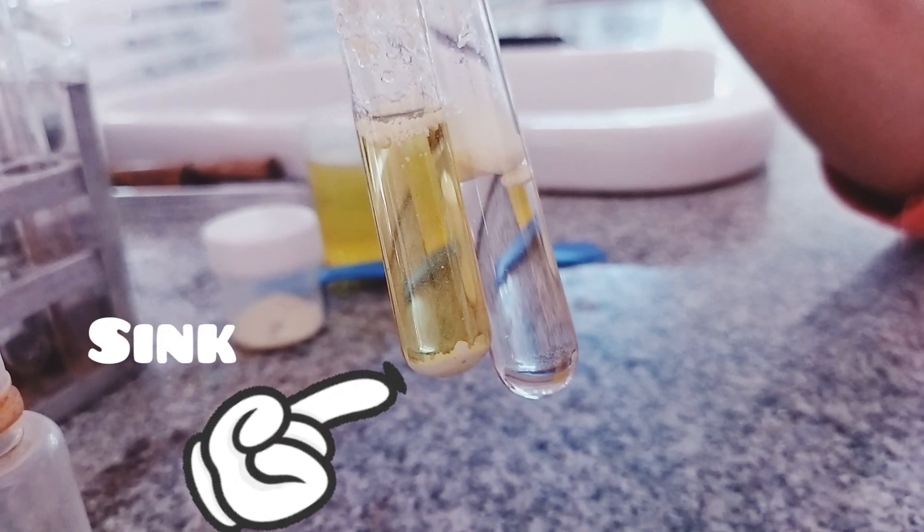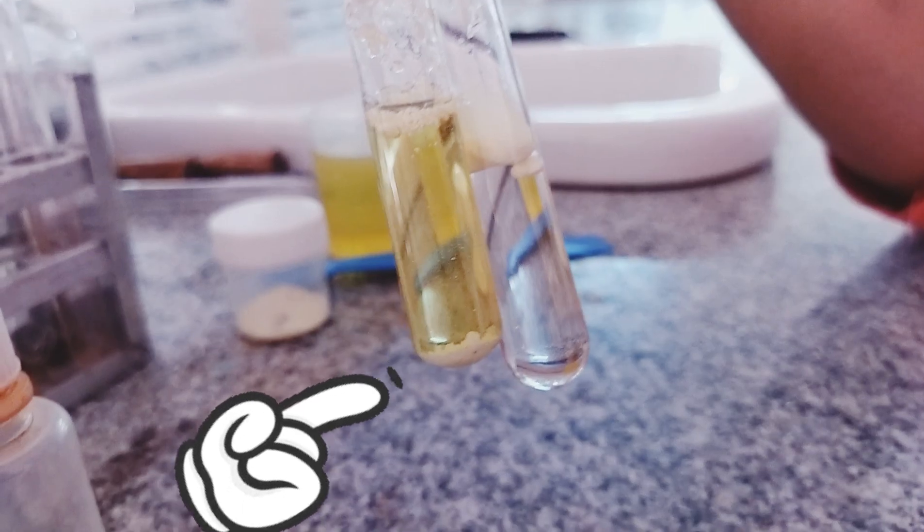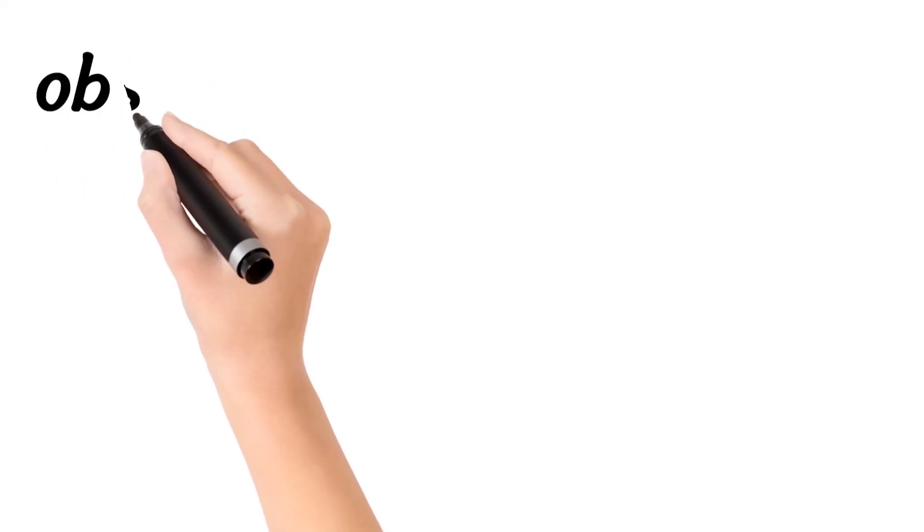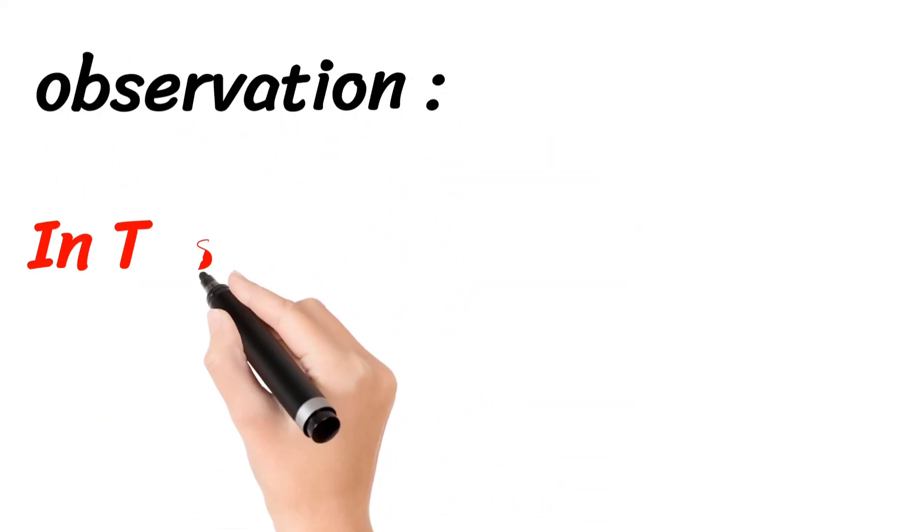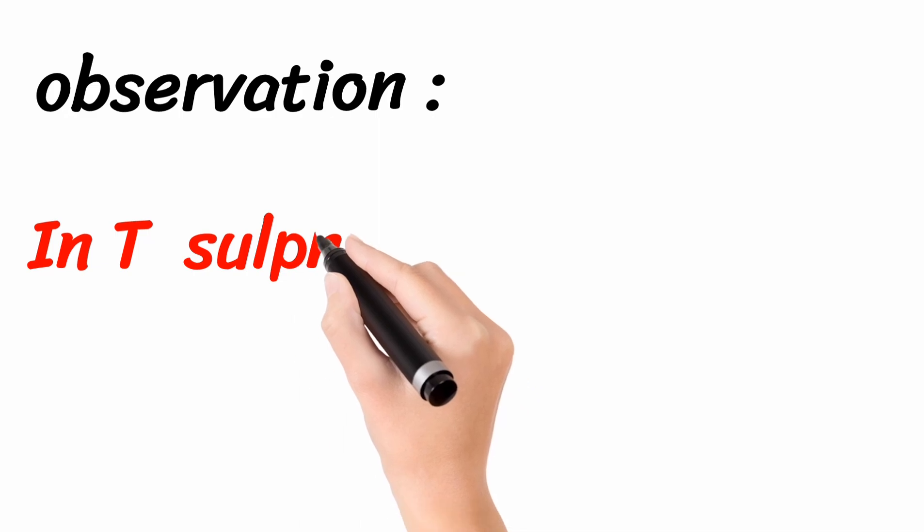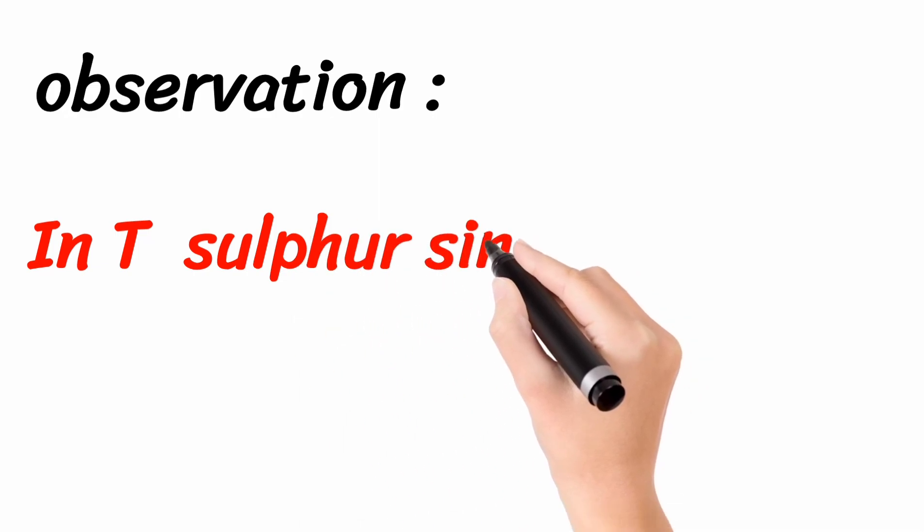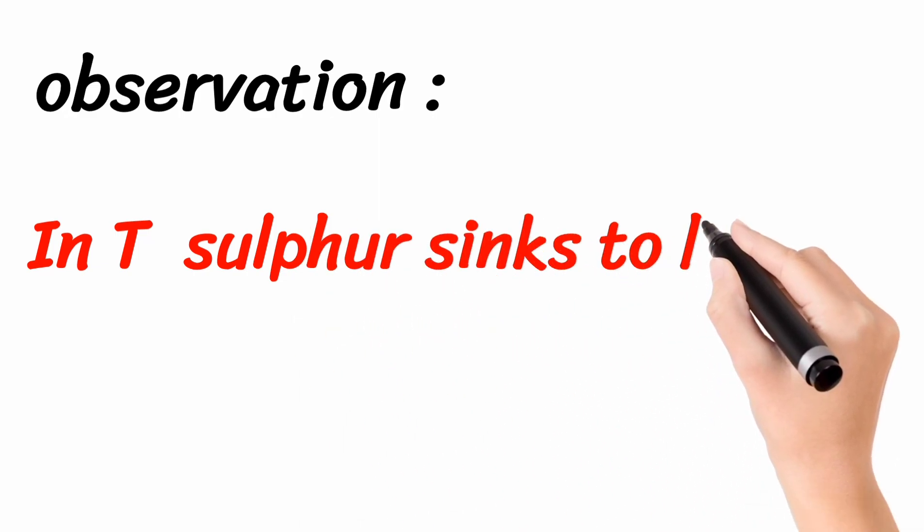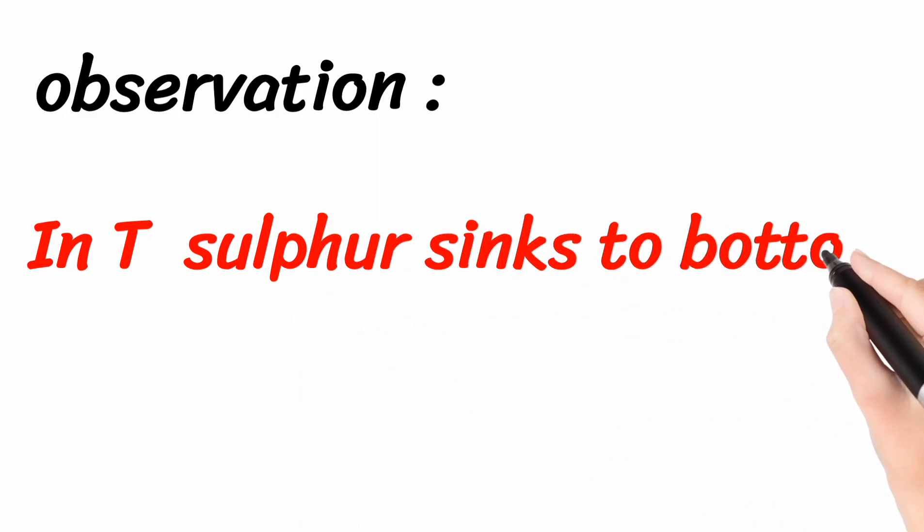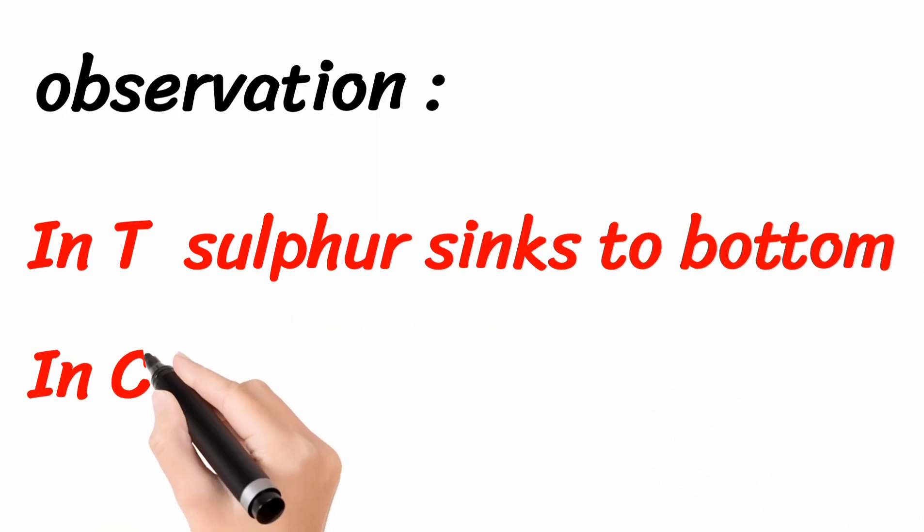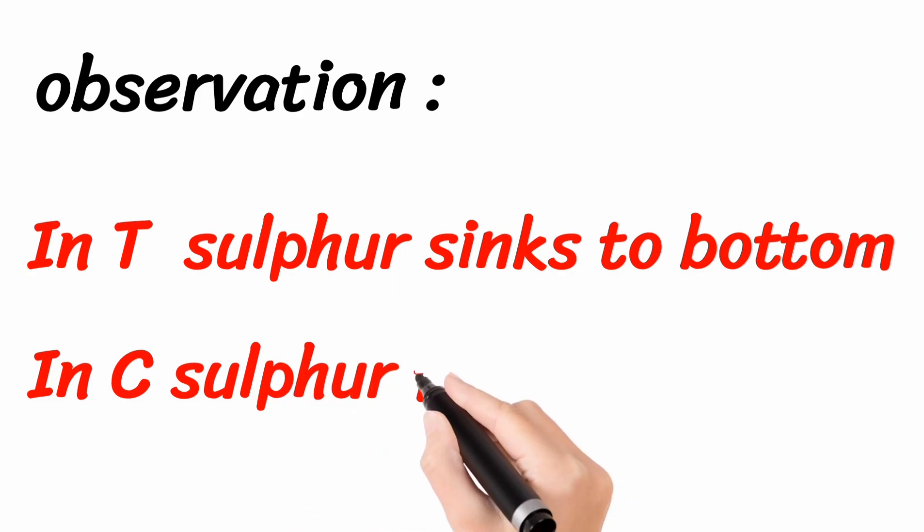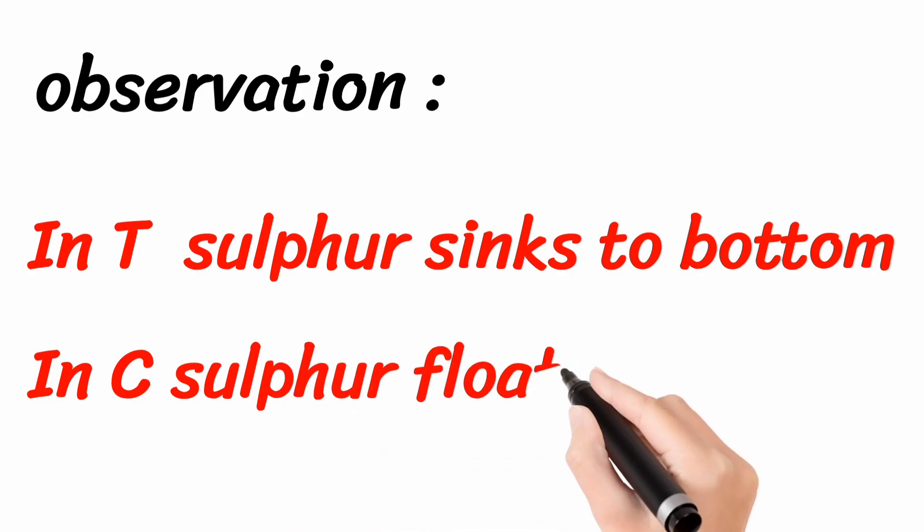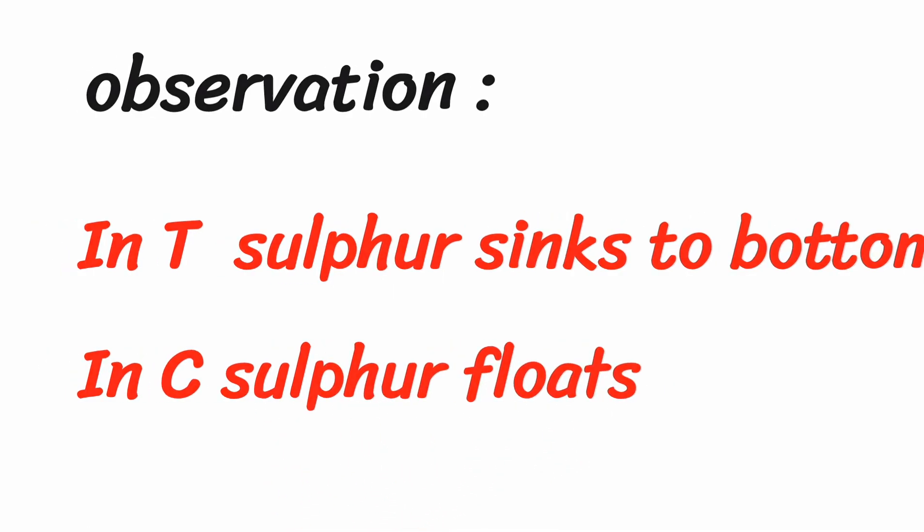So, this is the Haze Sulphur test. The observation is, in T test tube, the Sulphur powder sinks to bottom. In C test tube, Sulphur powder will float.